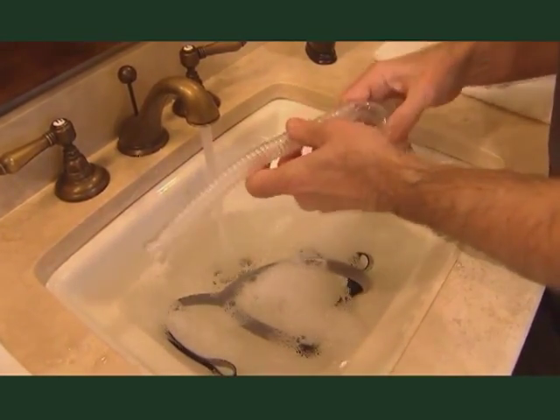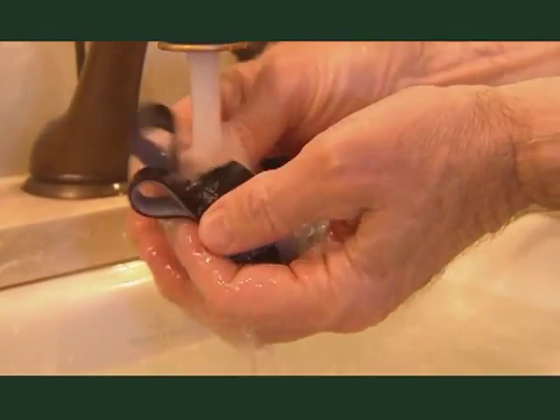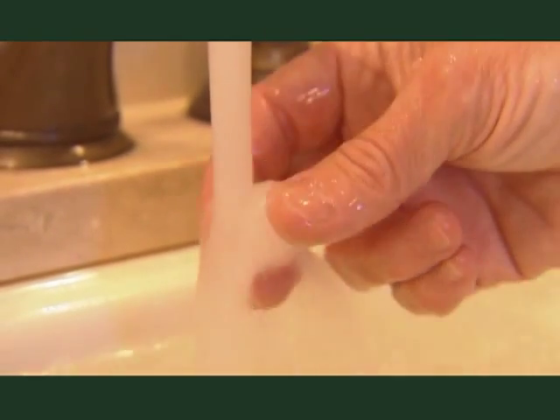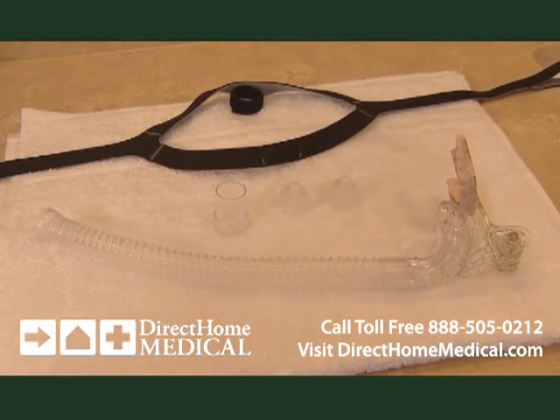Refrain from using any soap that contains moisturizers, antibacterial, antiseptic, alcohol, bleach, or chlorine agents. Thoroughly rinse with cold water to remove all soap residues, and then place the components on a towel to air dry out of direct sunlight.